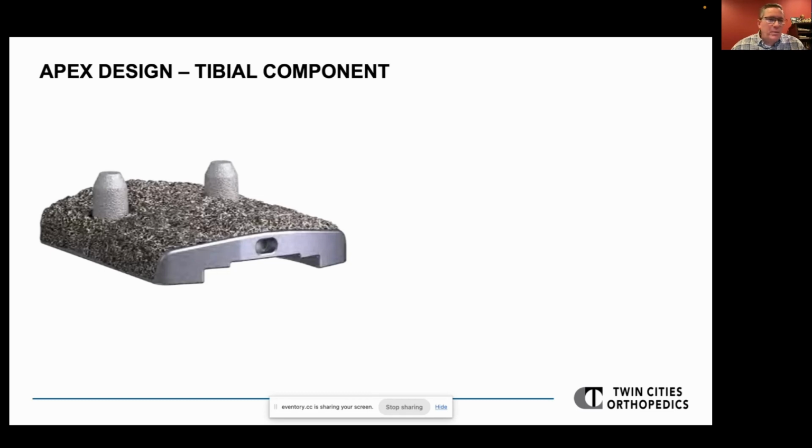And for a long time, my biggest concern and what I was most paranoid about was failure on the talar side. I was worried about AVN of the talus. We saw some cases earlier of failure where the talus has developed AVN. And certainly that concern has not gone away. But as I've practiced longer and put more of these implants in, I feel like I've seen just as many problems, if not more, on the tibial side than I have on the talar side. Probably again with this lack of initial ingrowth or early loosening of the tibial component.